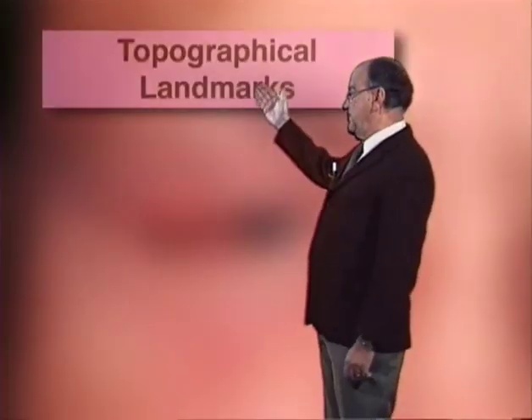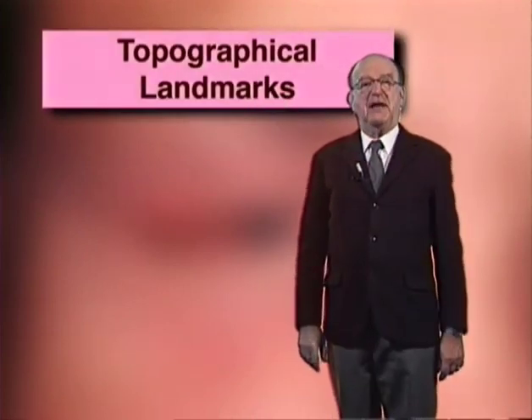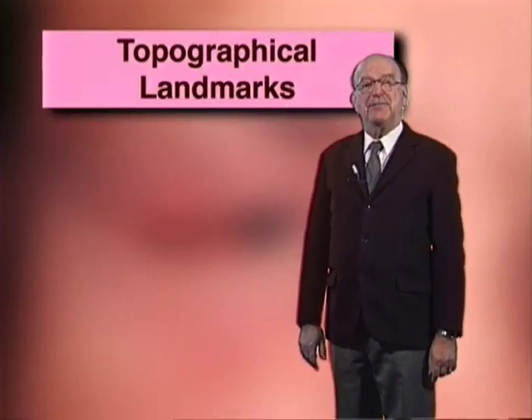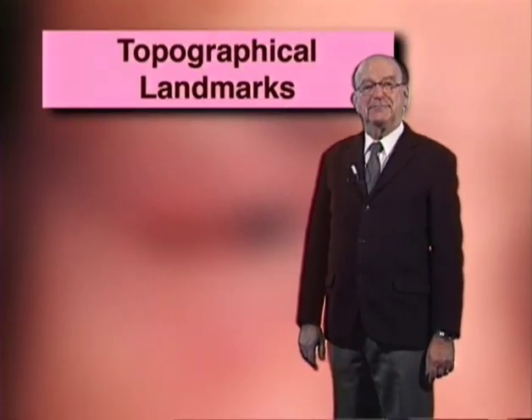Welcome to Biomicroscopy of the lids. This video course will introduce you to the examination of alterations at the lids. In order to achieve this goal, the first chapter on topographical landmarks will show you how to find your way in the microanatomy of the lids.